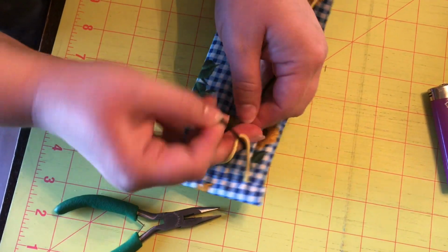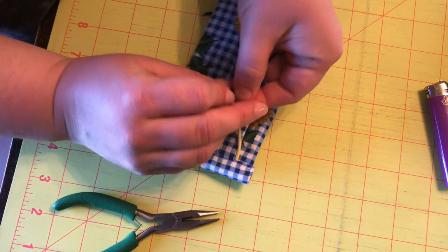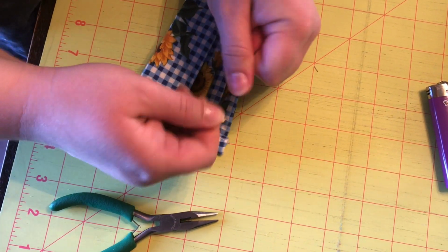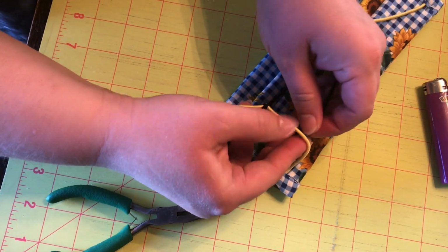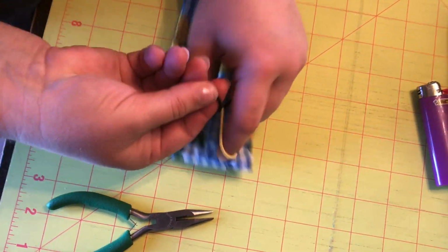I'm going to put 2 of these on here. So that way it'll hold it like higher and lower. And for most people, this is helping. There are some men's ones that are still larger that we're gonna have to make the masks larger and really, really pull this tight so it doesn't snap off. But this seems to be helping to relieve some of the pressure.